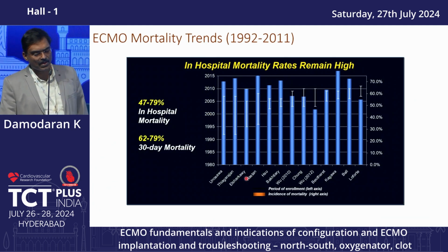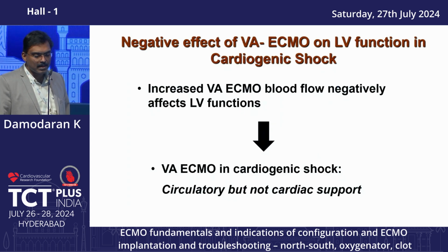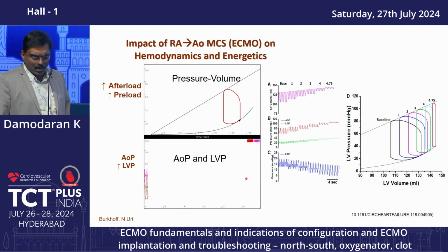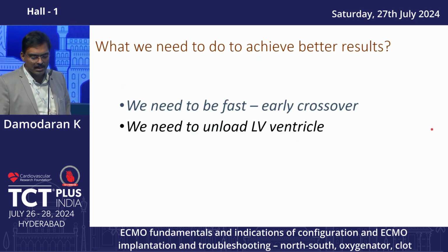Cardiogenic shock, I just touch upon it. Having said much about ECMO, you see the mortality is dismal, very disappointing. Why is it so? Because this is not a cardiac support device, this is only a circulatory support device. And you can see, when the flow goes from 1 to 4.75 liters, naturally the stroke volume decreases, the LVEDP and LV systolic and diastolic volume, everything goes up. So you need a kind of venting.